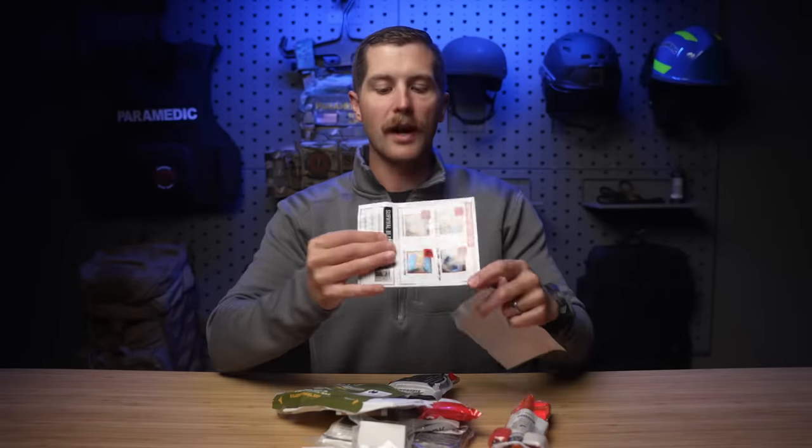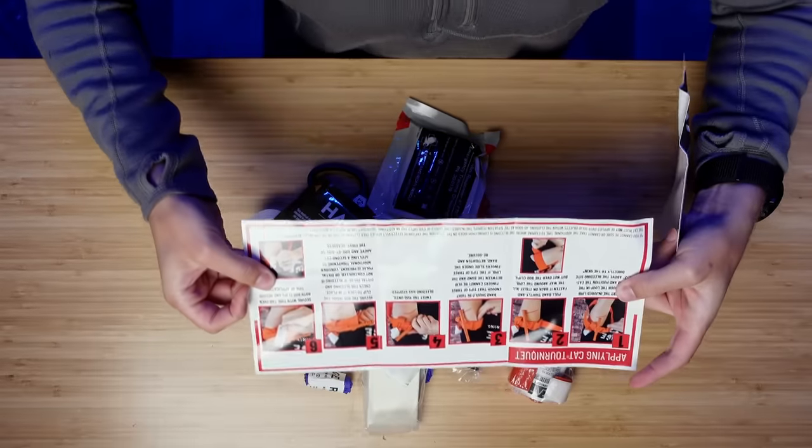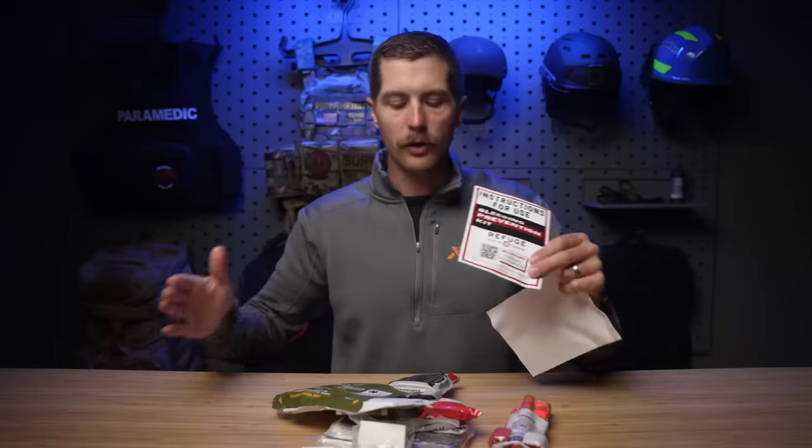Here we've got an instruction manual that's inside the kit, and it's got a QR code for detailed instructions. It teaches you how to use the pressure bandage, the tourniquet, as well as a chest seal. I think this thing's great and I like the QR code. But I wish this QR code was on the outside of the kit so you could access it and actually learn how to use these things before opening it. Their intention might be to take it out of the case, but if it's vacuum sealed, I want to keep it in there if possible because it protects it from the elements — although having something in a case is going to make it harder to access when time is of the essence.